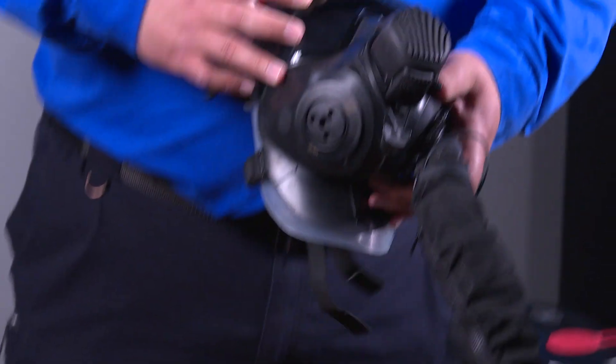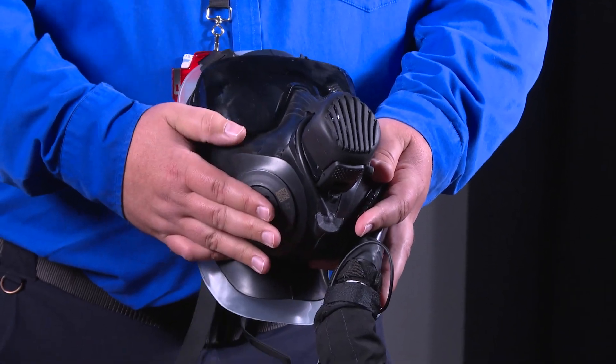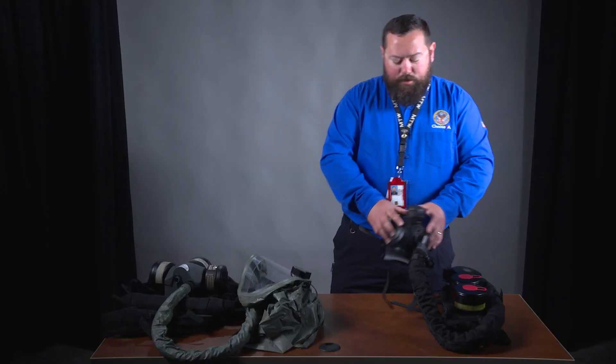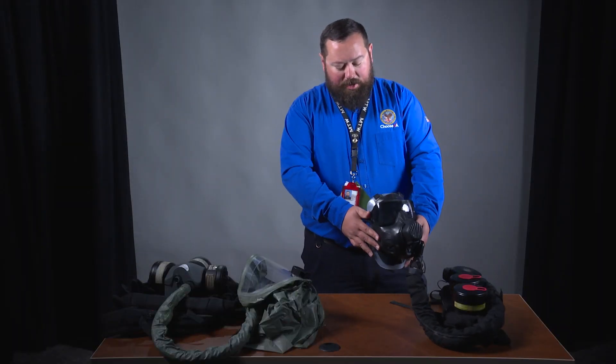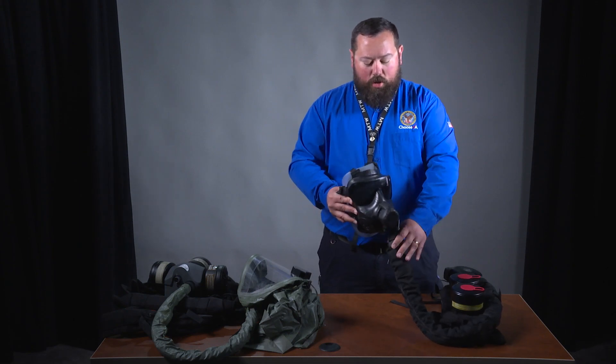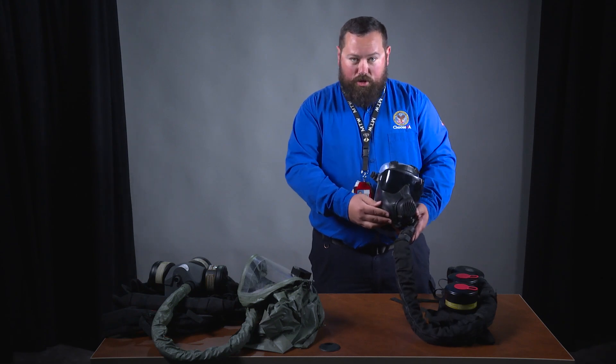This mask can be set up for either left-side or right-side air inhalation. The reason for that is because, as a VA police officer may need to use their firearm, a right-handed shooter would want the hose on the left shoulder, and a left-handed shooter would want the hose on the right shoulder.